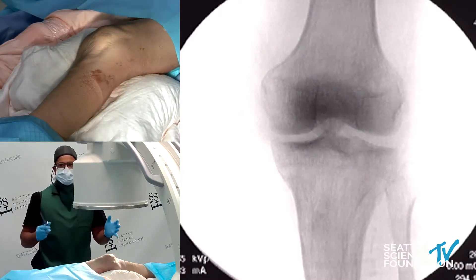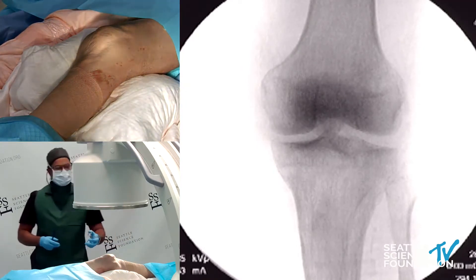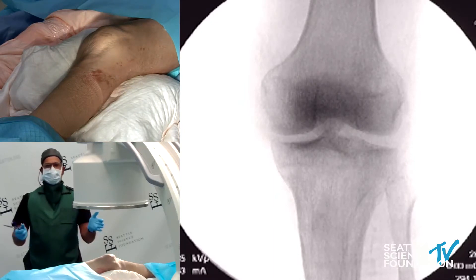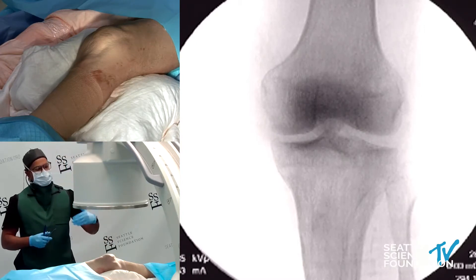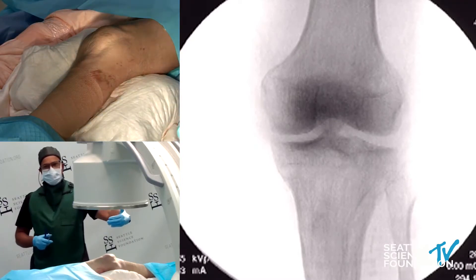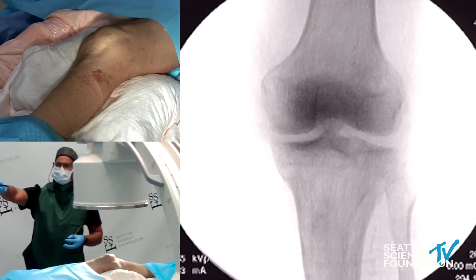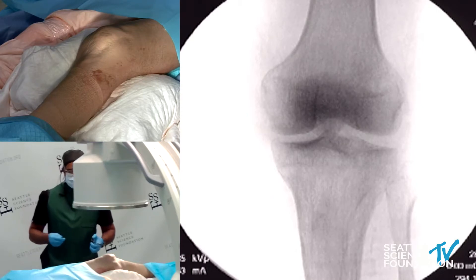Positioning is so important. Everything we do, it is particularly important for this particular procedure. One of the common tendencies for patients is to externally rotate their legs as they lie down supine on the table. So one of the things I really strongly encourage you to do is tape with some internal rotation of the femur so that you can actually have the joint basically fully AP. What Justin has done here is put the patella right in the midline of the femur and tibia, and you can see the tibial plateau is fairly level.